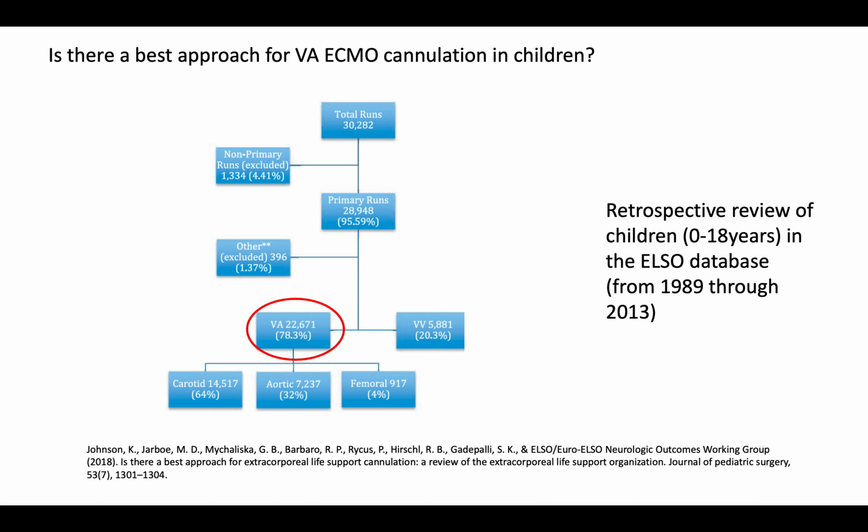The best approach for VA ECMO in children remains unknown. Which site carries a better prognosis remains a matter of uncertainty. Clinicians have been taking a pragmatic approach as a result. There are some retrospective studies from the ELSO database which we will review now.